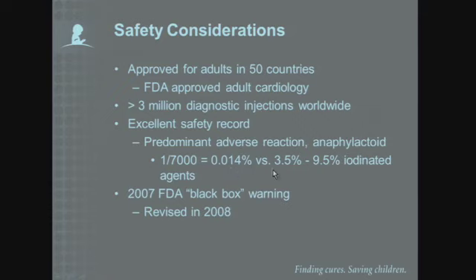And this is much lower than the rate of anaphylactoid reactions that we see with iodinated contrast agents. Despite this, in 2007, the FDA issued a black box warning for these contrast agents, which was subsequently revised in 2008. And I want to spend a little time talking about these black box warnings and where we stand today.